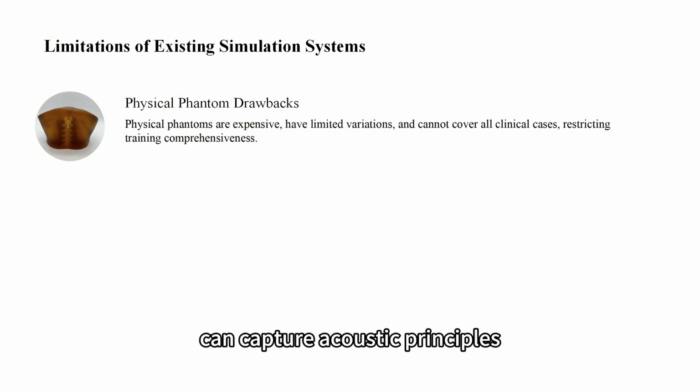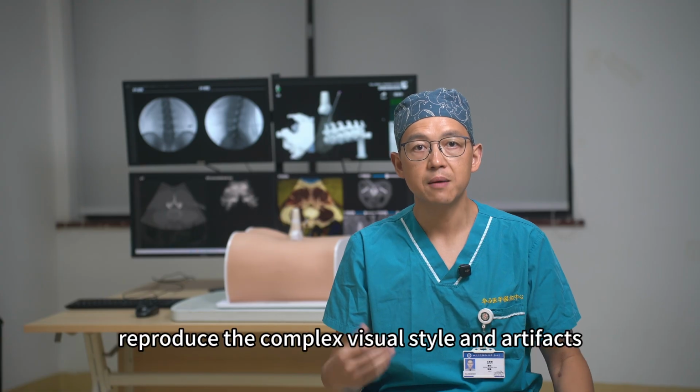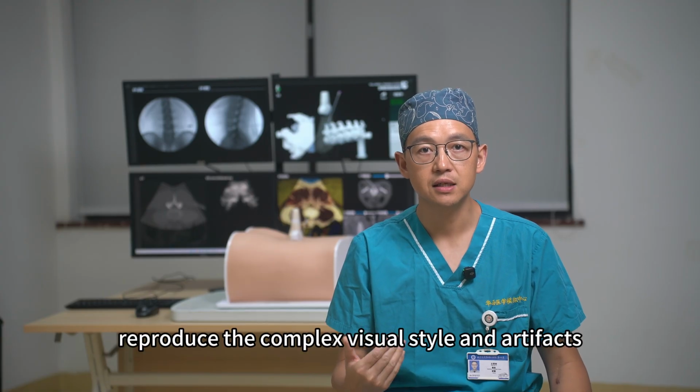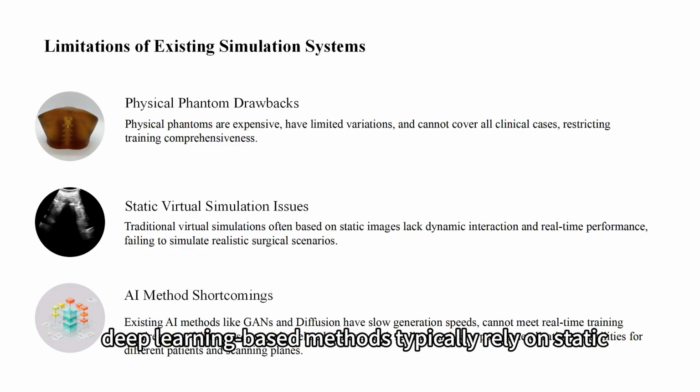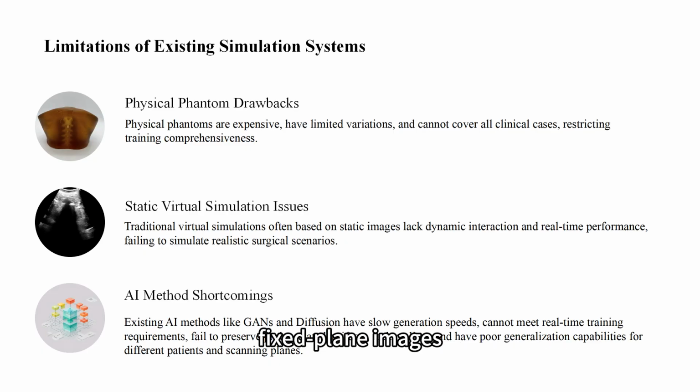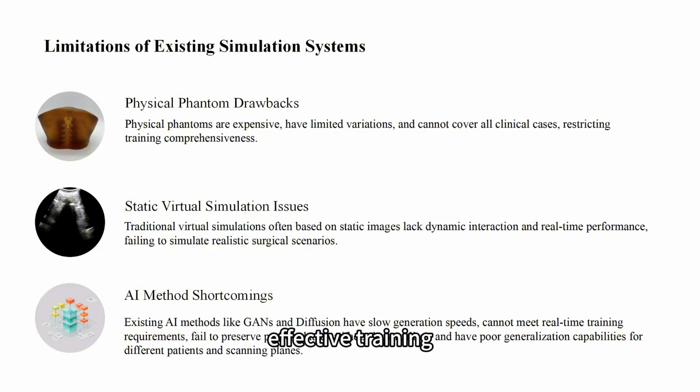Physics-based simulation can capture acoustic principles, but often fails to reproduce the complex visual style and artifacts seen in real clinical ultrasound. On the other hand, deep learning-based methods typically rely on static, fixed-plane images and struggle to deliver the dynamic and real-time performance required for effective training.